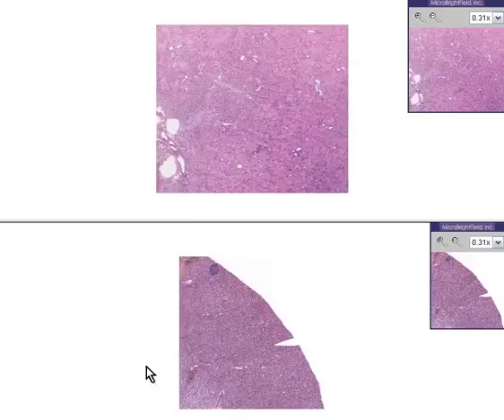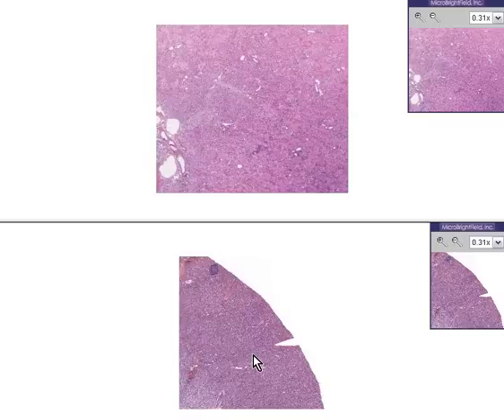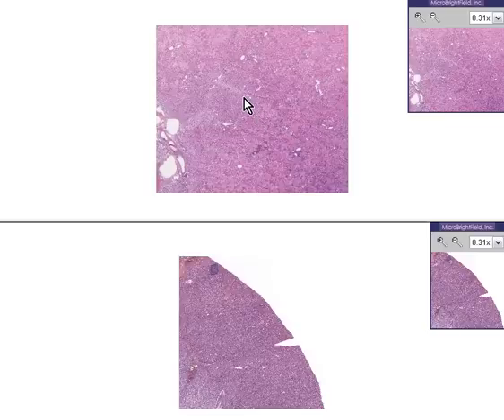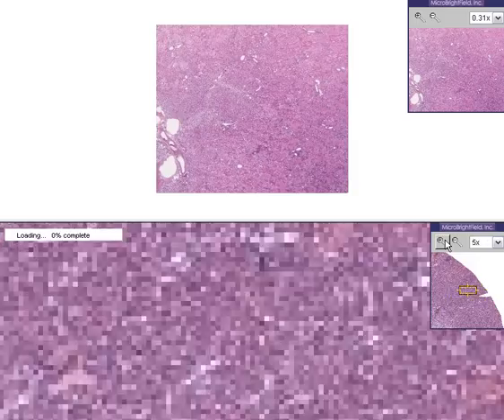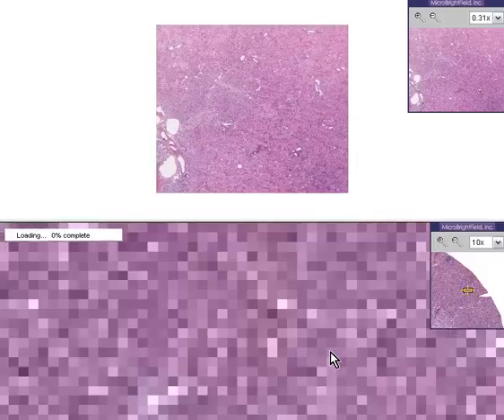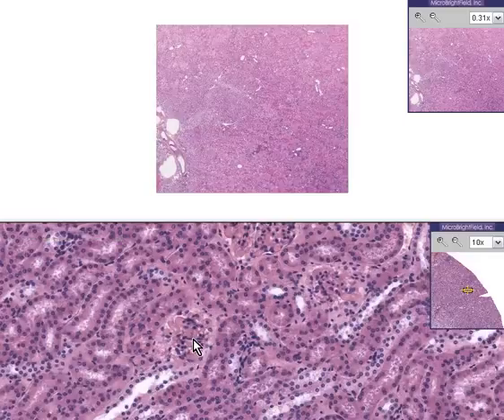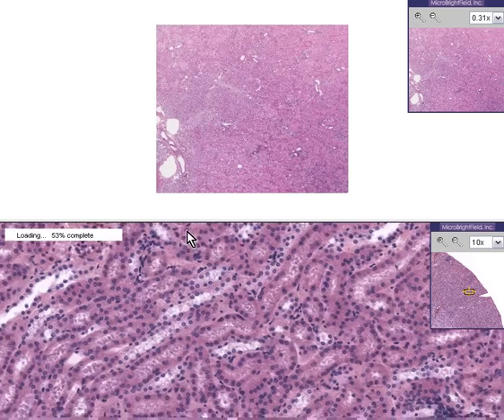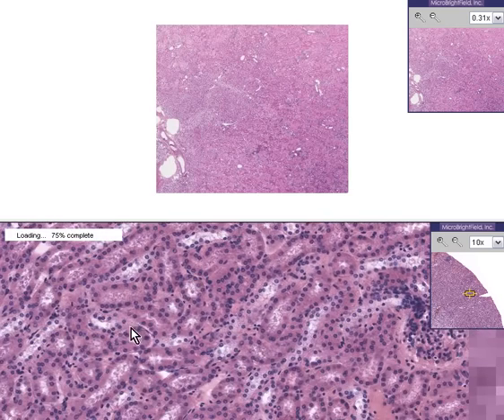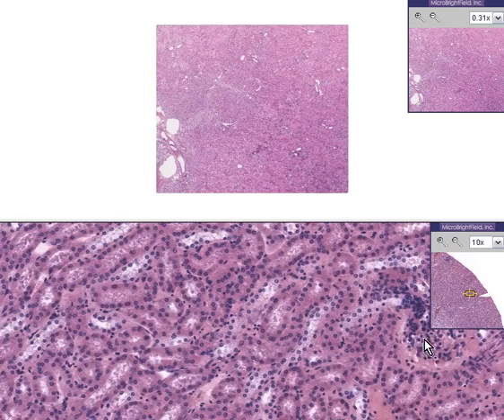Here is a normal kidney in the lower part of the screen, and here is an abnormal kidney in the upper part, which we will explain in more detail. Let's zoom in a little bit on the normal kidney. Anywhere you go in this cortex, you can see part of a glomerulus, and chiefly proximal convoluted tubules — most of these are proximal convoluted tubules.